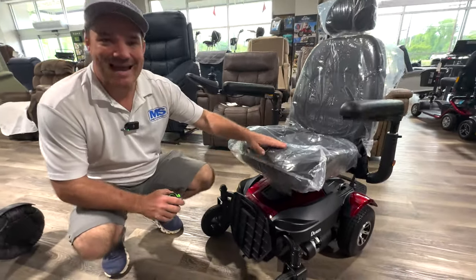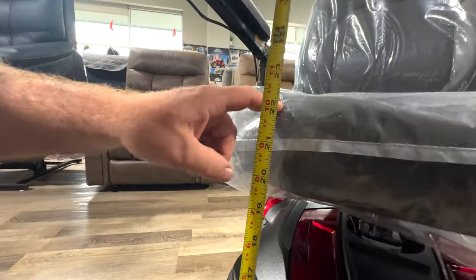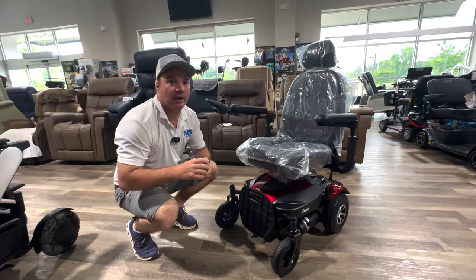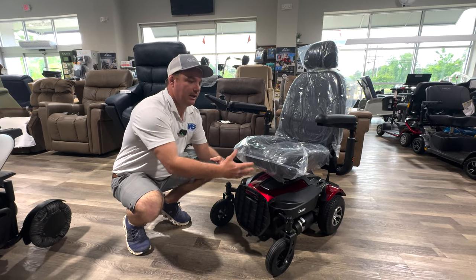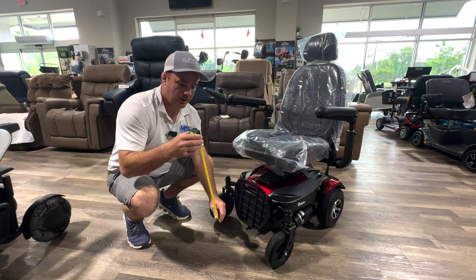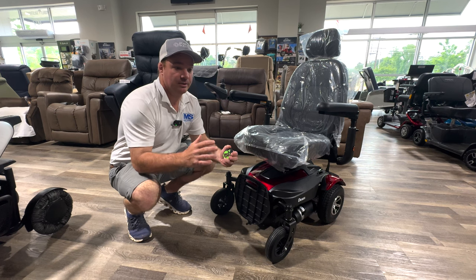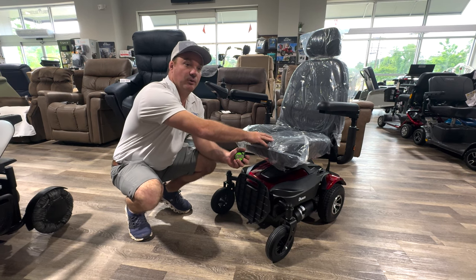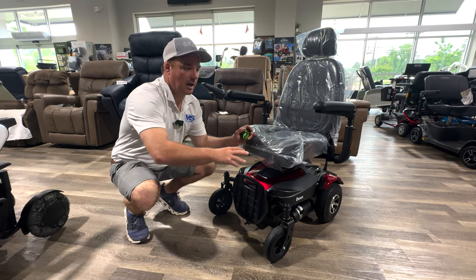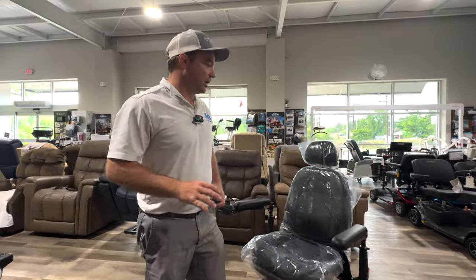If you're shorter — say five-one, five-two, maybe five-three — or if you have short legs, be aware that because this chair has an elevated seat, the seat height is almost 23 inches from the floor. Sit in a chair at home and measure from the floor to the seat height. If a comfortable chair for you is 19 or 20 inches, then 22 or 23 inches may be too high — hopping up into it or getting out could be an issue, and your feet may not reach comfortably. So keep that in mind; there are other chairs out there.